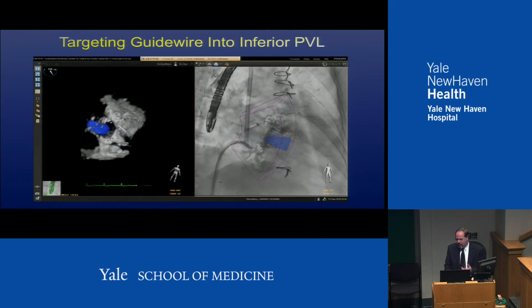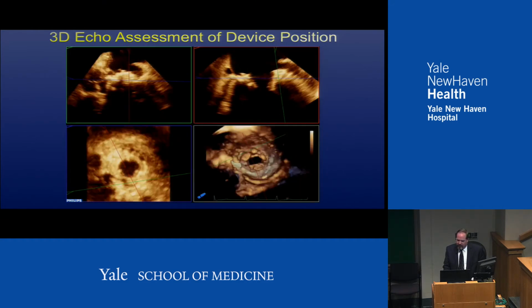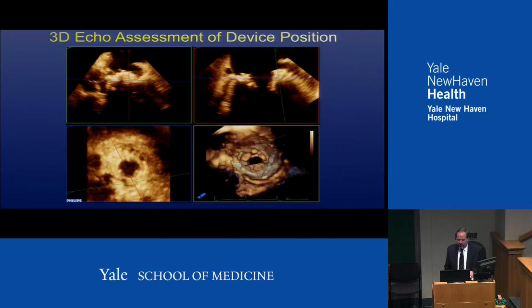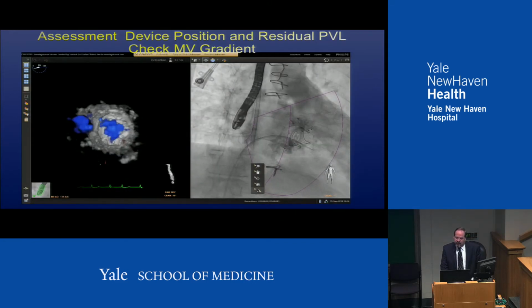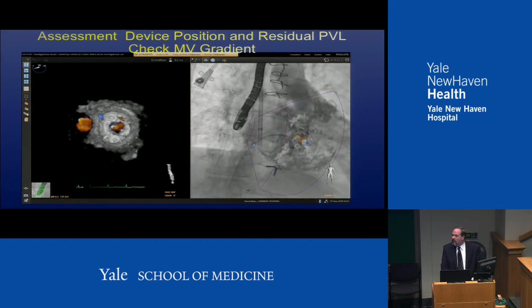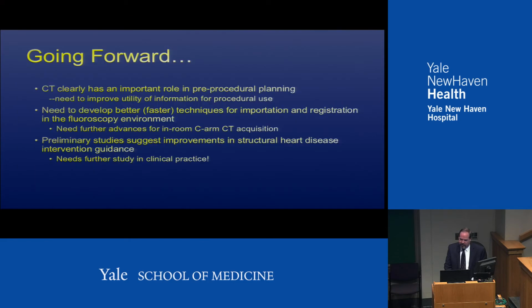This just shows that we were defining the exact position, staring into it. These are 3D images showing the planted, as I call them, evergreen trees. There on the upper left, you can see a bunch. And then on the short axis, 3D image on the bottom, you can see there are 3 up on top and 1 below. So we put in 4 devices in this patient in about 2 hours. And you can see there's still a little bit of a superior leak, but compared, the inferior leak is gone, and the patient, by other techniques, only had mild regurgitation.